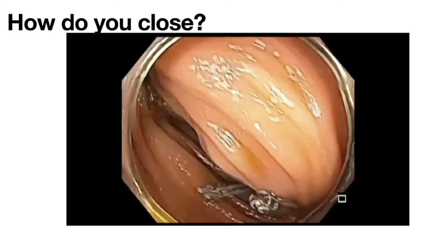Let me ask Selvi. Selvi, what do you do when you see patients with HNPCC or attenuated FAP? Do you make sure that you routinely do chromo? So, Raju, I think I have the same experience that you do in terms of doing mechanical chromo, I call it, spraying the mucosa, suctioning up the puddles, and then examining the mucosa for flat lesions.